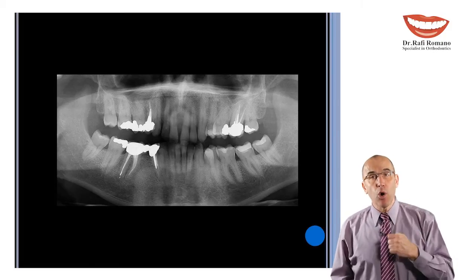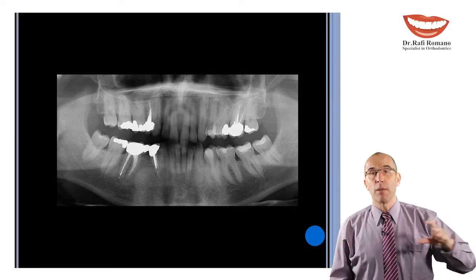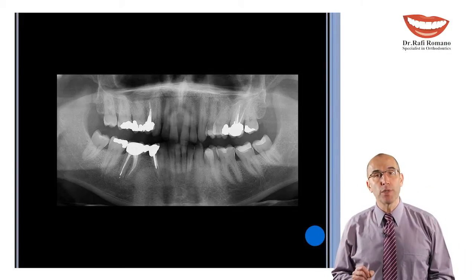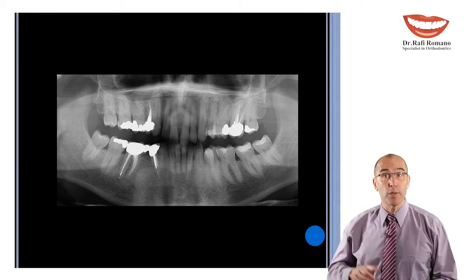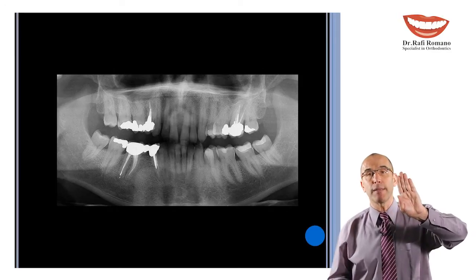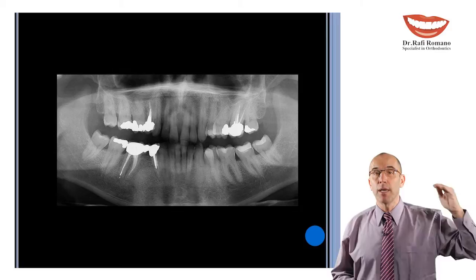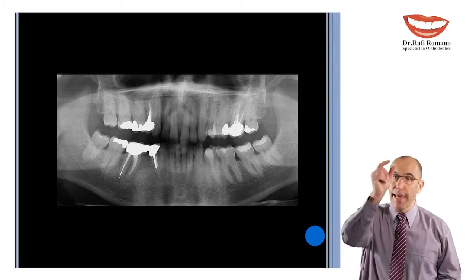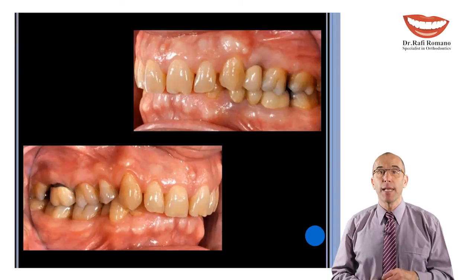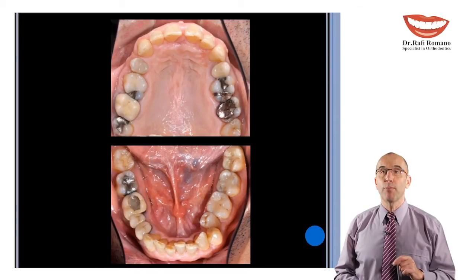Now, I always look also at the X-ray records, panoramic, periapical, photos, and sometimes cephalometric, because if we want to upright the tooth, we do not look at the incisal edges which are abraded. We look at the angle of the root in order to place the bracket correctly. Now you can see what happened to this patient after we put a Joy bracket.